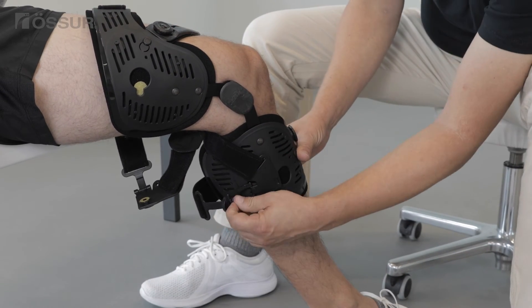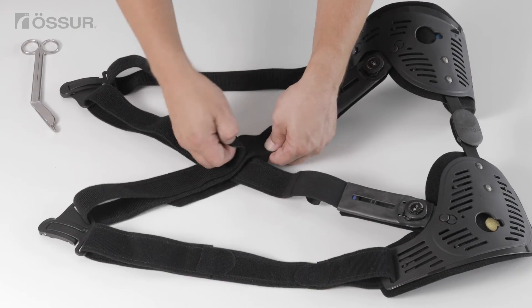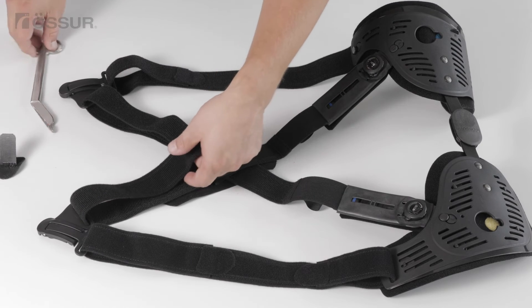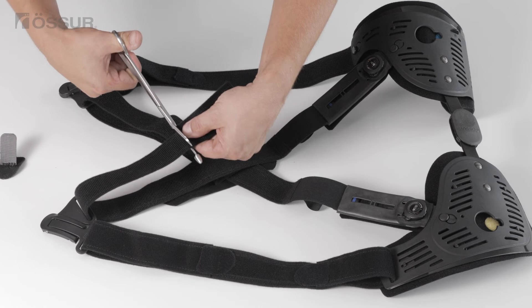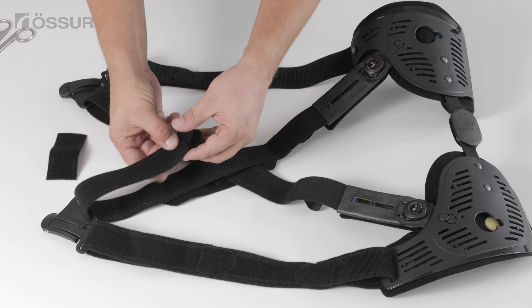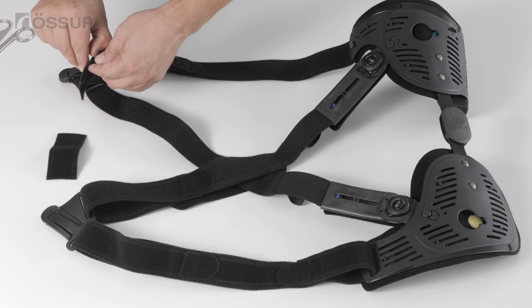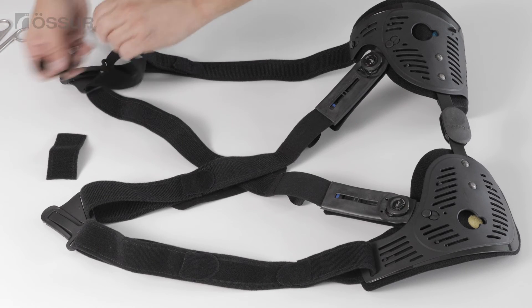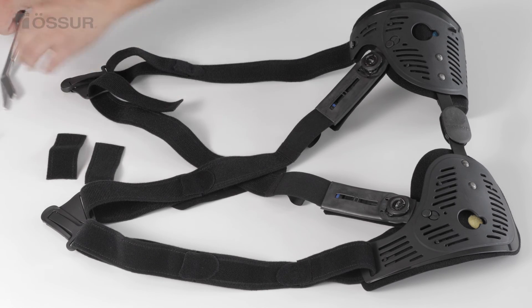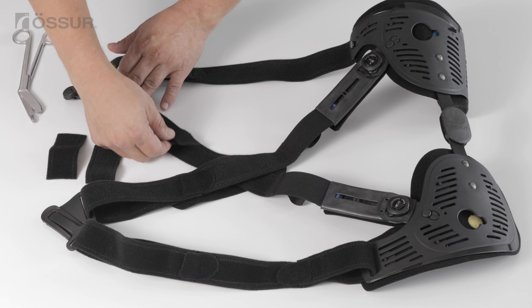Undo the brace and remove it from the leg. Trim the straps, ensuring that the alligator clips are not positioned in the popliteal region to avoid bulk. Reapply the brace for a final fit check.